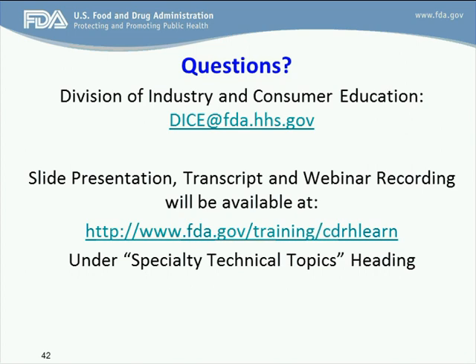Understood. Thank you very much. One additional follow-up question. As relates to simulated use of the device, historically, in simulating the use of the device, we have been employing approximately 10 cycles under the guidance of the agency. And now that we're reading the newly issued guidance, the guidance makes a reference to employing a statistically significant number of cycles during simulated use. My question is, can a device manufacturer anticipate that the number of simulated use cycles that they will be required to perform will now evolve to something other than the standard 6 to 10 cycles that have been employed previously?